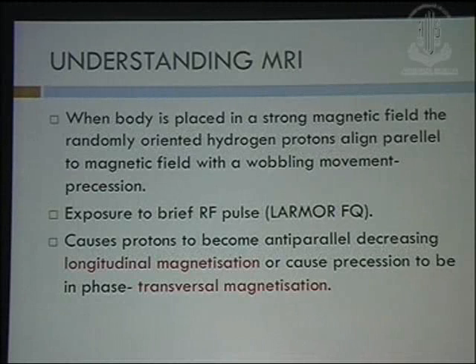Now, understanding an MRI: I would say the patient is put in a big MRI machine, and the MRI machine is like a school teacher which aligns all the protons inside the body in a single direction.